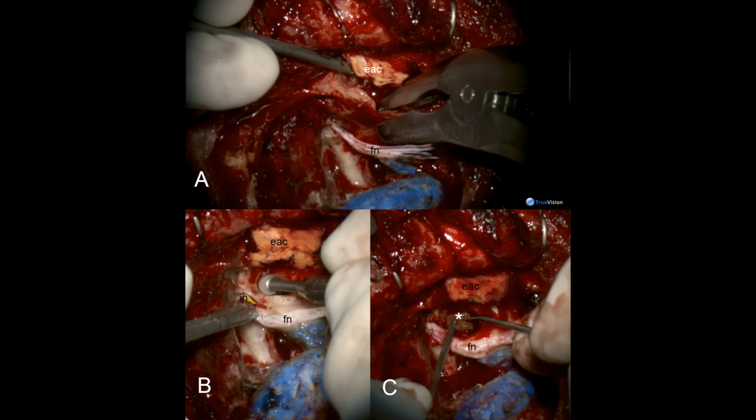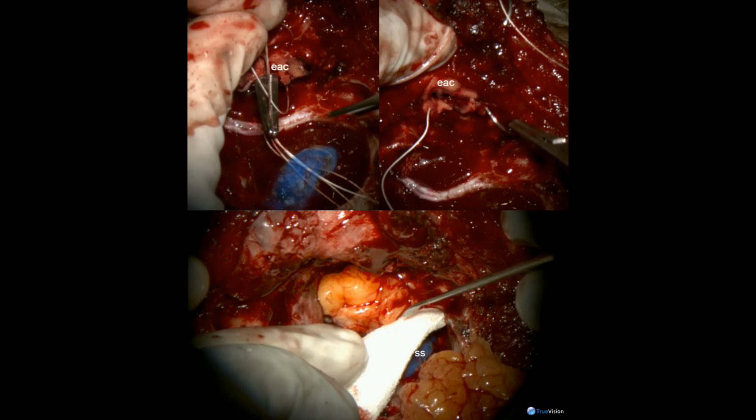In Panel A, the external auditory canal is removed, drilling down to expose the middle ear. The eardrum, ossicles, and canal skin are excised. In Panel C, the eustachian tube is plugged and the canal is blind sacked and overclosed to complete the petrosectomy. The next panel shows the oversewn canal. Because the tumor removal will be staged later, the cavity is filled with abdominal fat and the sigmoid sinus is covered with gelfoam, preventing adhesion.